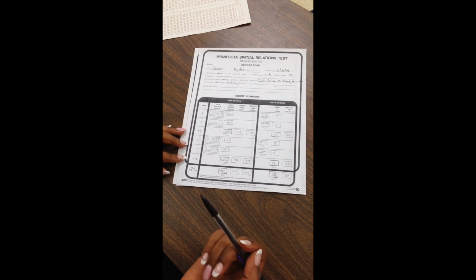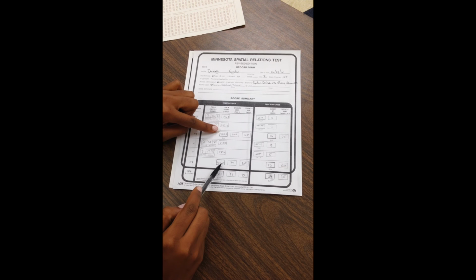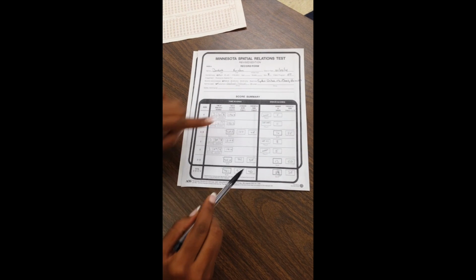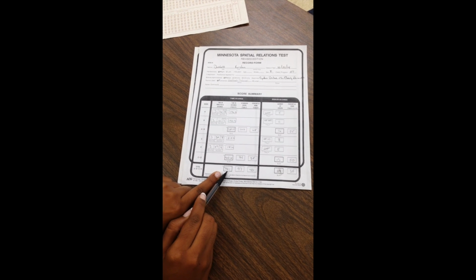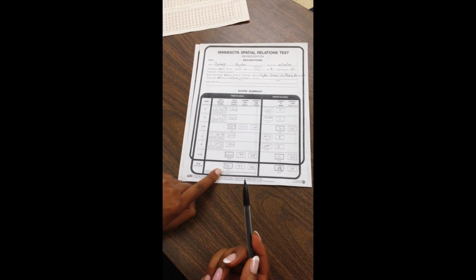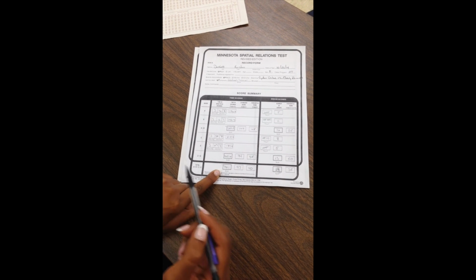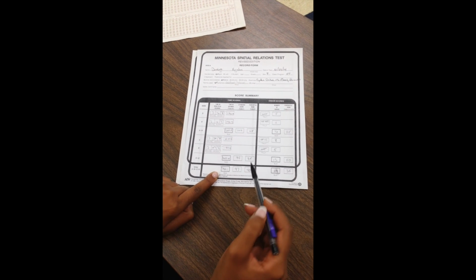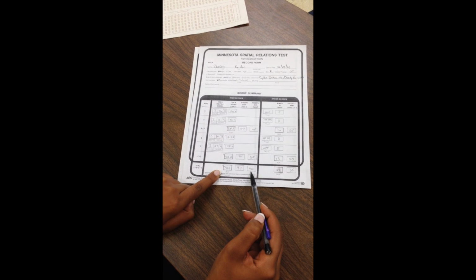Make note that after you convert your minutes into seconds for each board, you add your sums together for boards A and B and C and D, and you have a total sum at the bottom. In addition, you also refer to table 1 to get your standard score for the sum of all 4 boards, and refer to table 2 to get your percentile rank once again for all 4 boards.